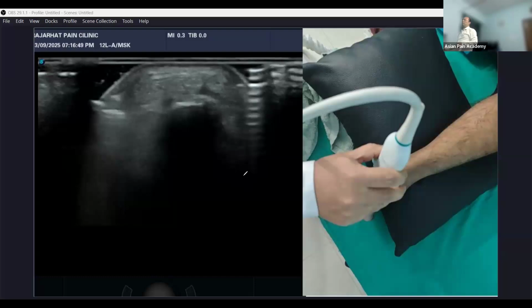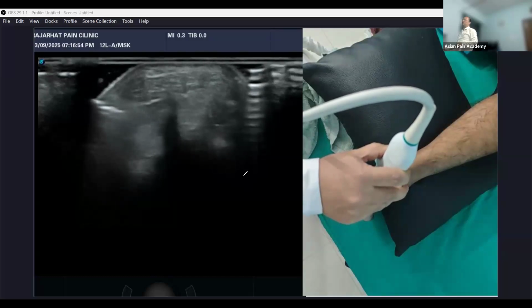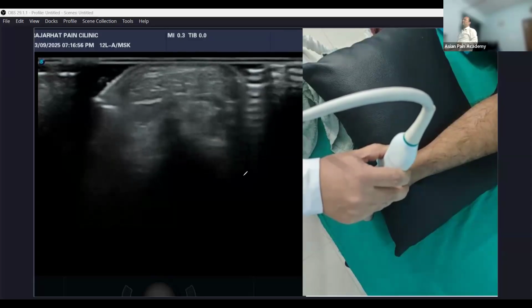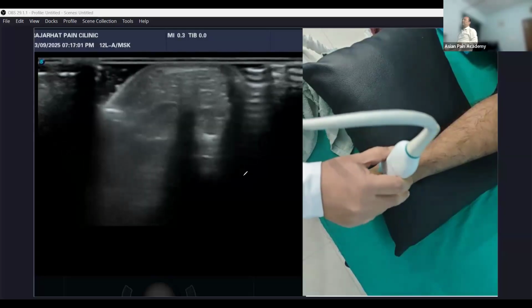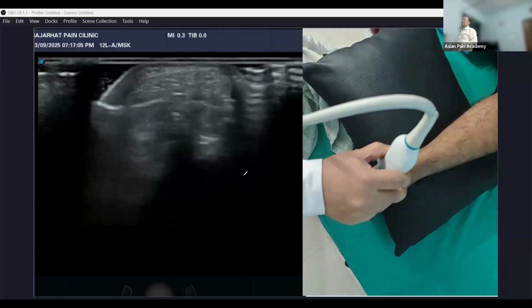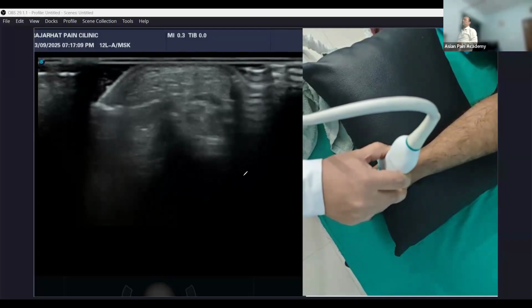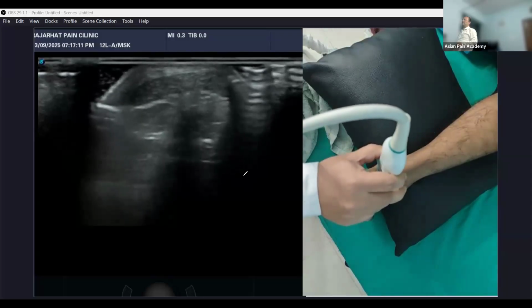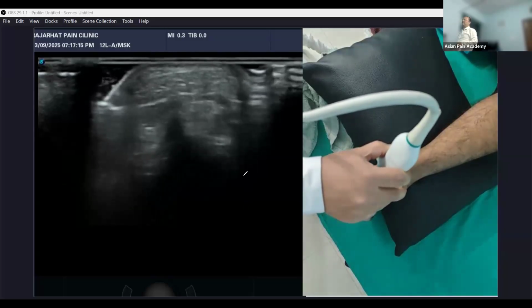And now I'm going up. Now suddenly the bone is very much down, so we can see the area. You can see the retrocalcaneal bursa area also. Some anechoic fluid is there. Actually, I'm pressing with the probe, so this anechoic area is going back. Now the most upper part is the tendon. Now I'm making it black and white. So this is the tendon.